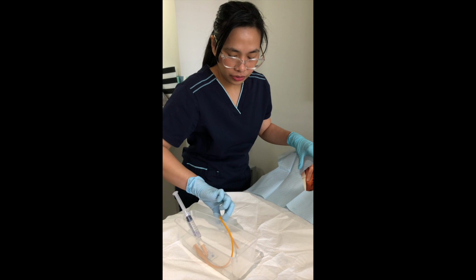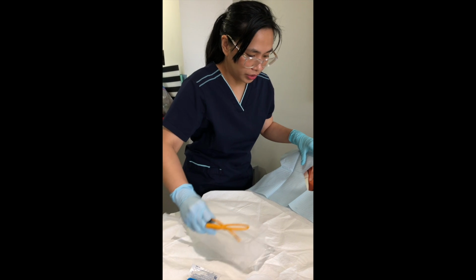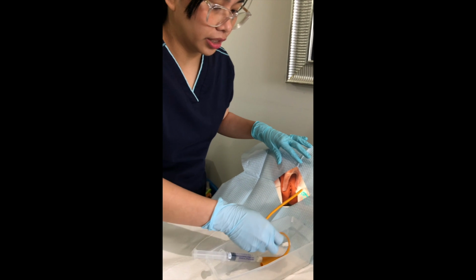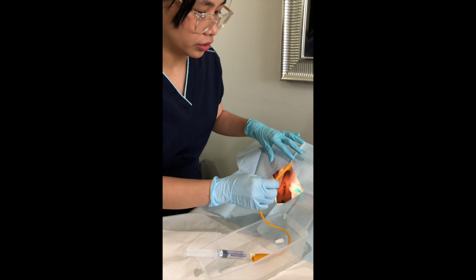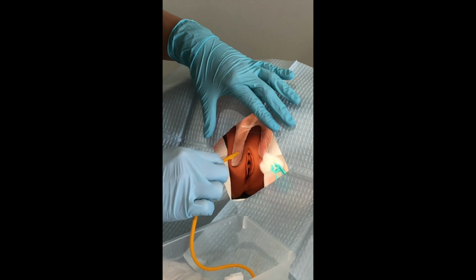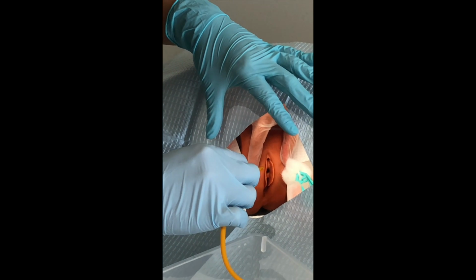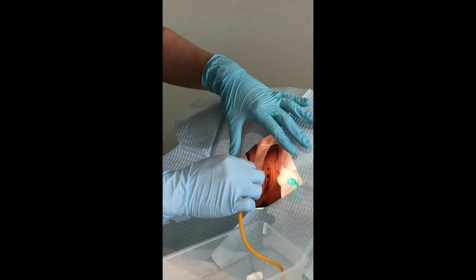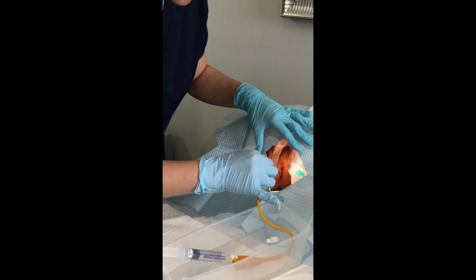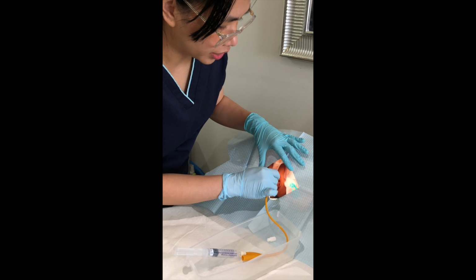Okay. So you can now insert your catheter. You can put this here. If you need to collect urine, you can just put the end on a container. Using your right hand, and while opening up the perineum, you can insert it on the meatus, the hole, and then insert approximately 5 to 7 centimeters. Once there's a backflow of the urine, you can advance more, another 5 centimeters.